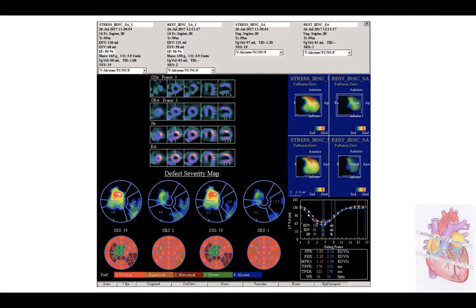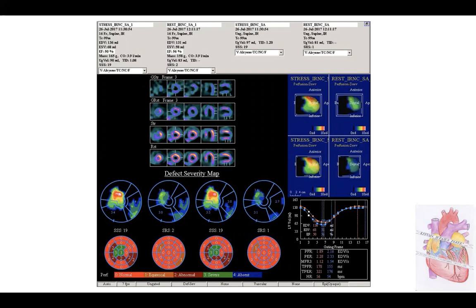If we analyze the data obtained by quantitative analysis, we can have information about volumes. The volumes at stress and rest are quite comparable, with a moderate reduction of ejection fraction after stress — 50% at stress compared to 56% at rest. This is due to the fact that we have stunning in the apex after the ischemic time during the stress acquisition. We also have information about the summed stress score.